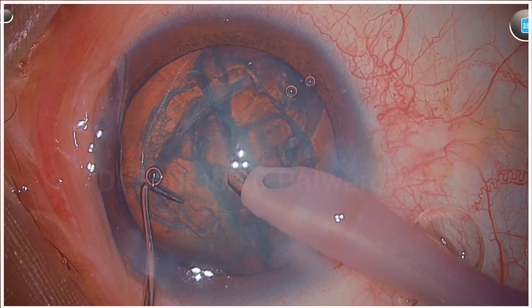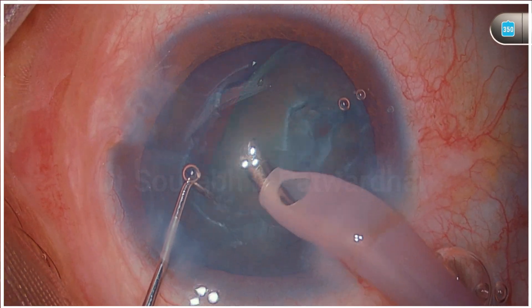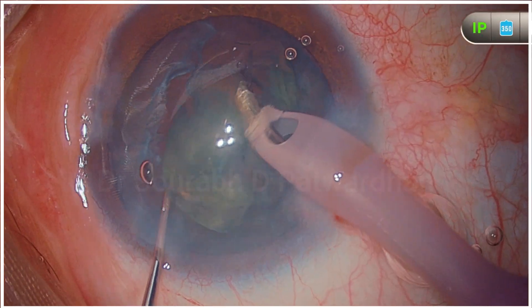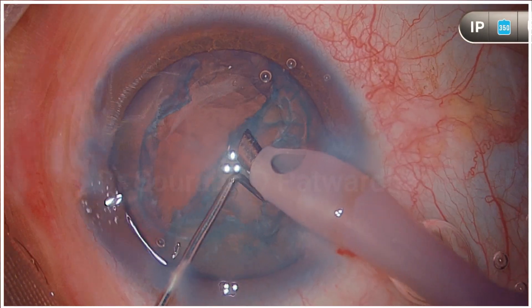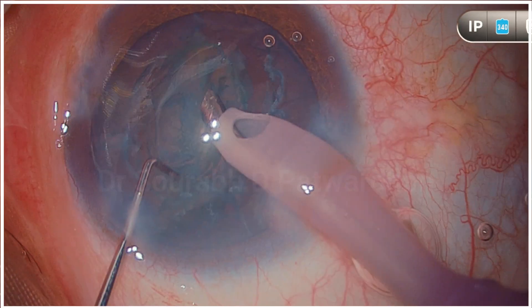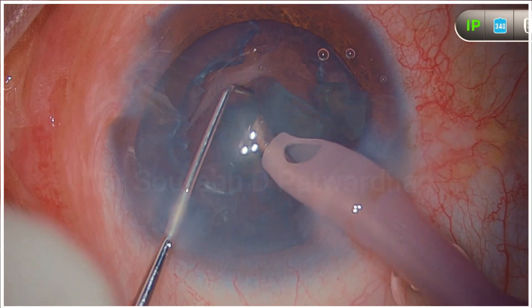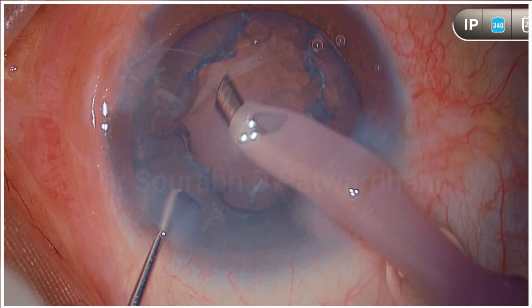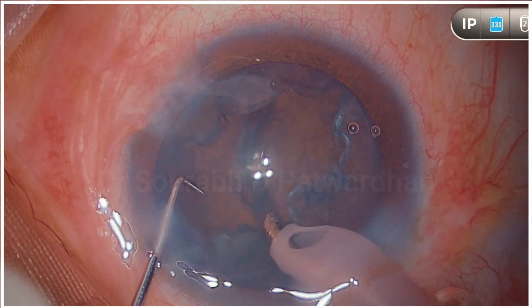Once it rotates, you can see that the nucleus is already separated from the bag. So now taking it out from the bag is very, very easy, and I could do it very easily. The trick here was to identify that the hydrodissection was not complete — I felt more resistance while rotating the nucleus — and that is the time you must stop and repeat hydrodissection so that the remaining surgery becomes easier and safer.